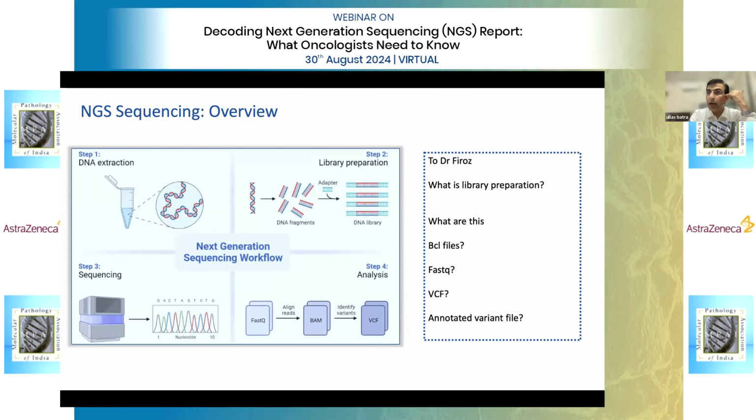And also, is it written in the file, or do you have to ask? It is usually written. It would also be a good practice to write that maybe RNA was tried, which we could not extract, or that the RNA quality was not very good and we could not do it, just in case.